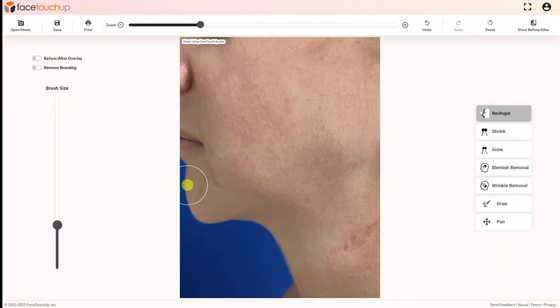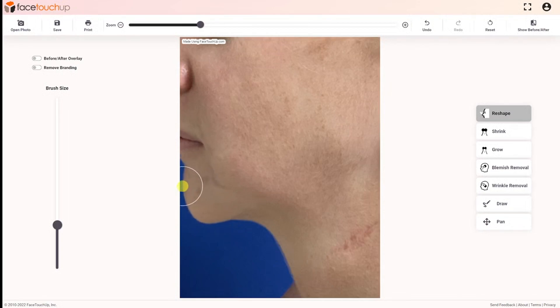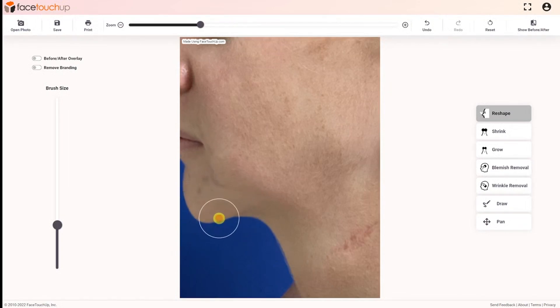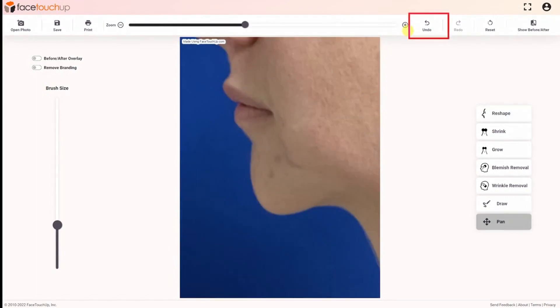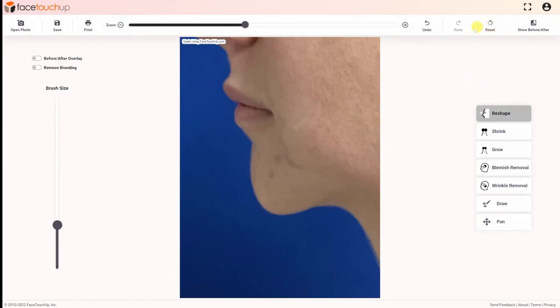Finally, tweak as necessary by using a combination of zooming and brush size. In order to edit the changes already made, there is an undo button to go back as many steps as needed. To reapply changes, use the redo button.